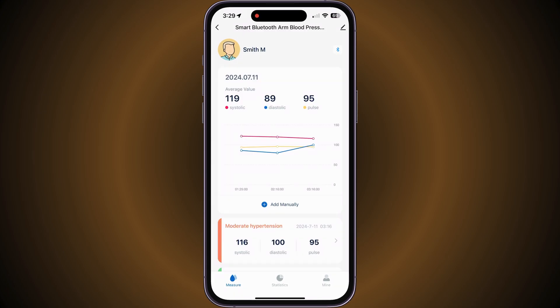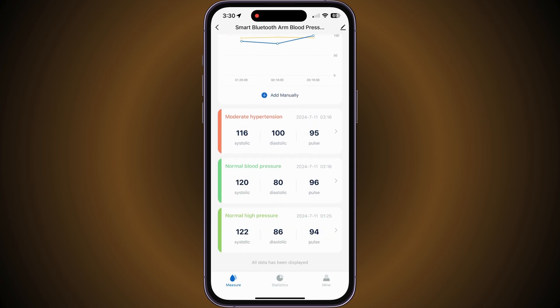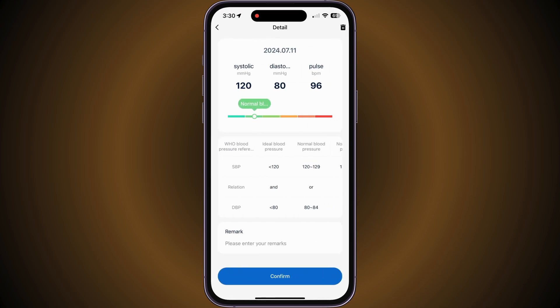On the main screen of the Smart Blood Pressure Monitor, taking a blood pressure reading will populate the results on the main screen and when you scroll downwards. Tapping on the results will give you more in-depth details on the reading.